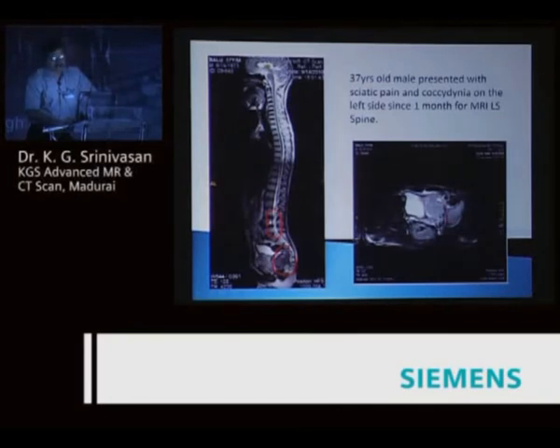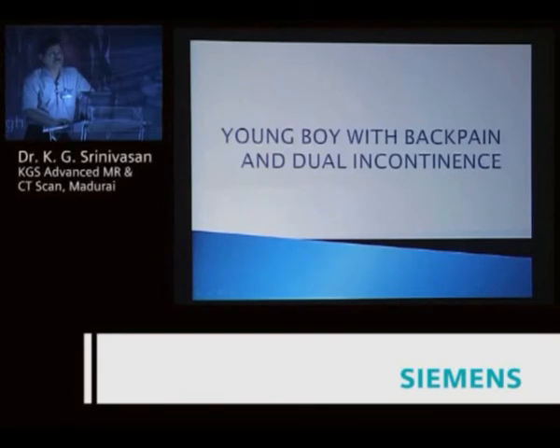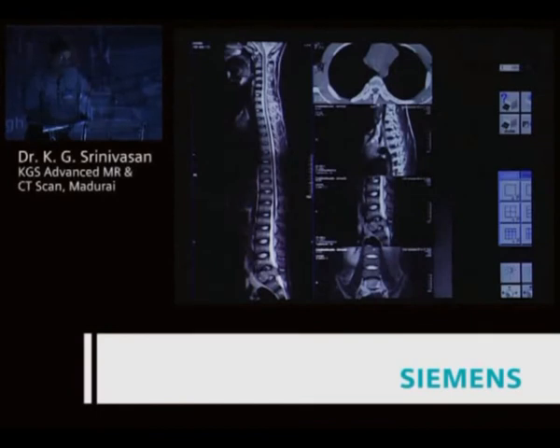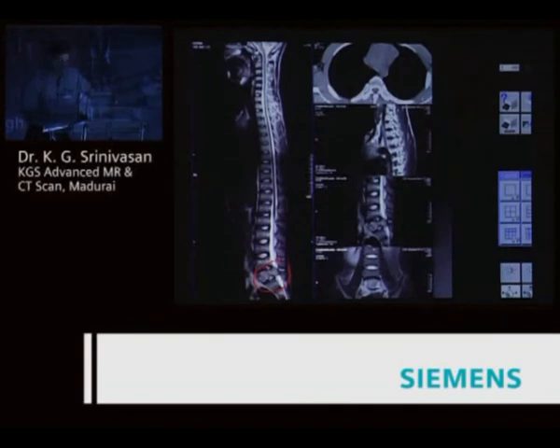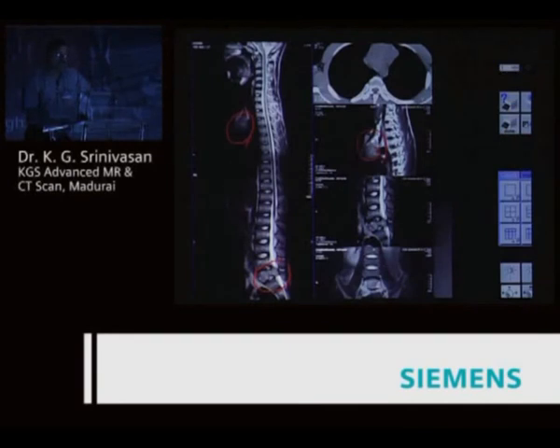Rectal mass with pre-sacral space infiltration, acetabular secondaries, and lymph nodal metastasis — all responsible for the left-side sciatica. Young boy with back pain and bowel incontinence: classical destructive lesion at L5, pathological fracture with bony fragments compressing the roots. Any specific clue? Looking carefully at the mediastinum, it is a proven case of malignant germ cell tumor of the mediastinum with metastasis to L5.